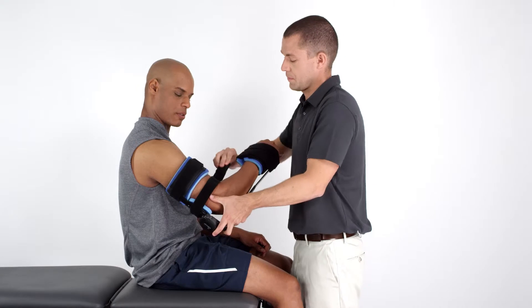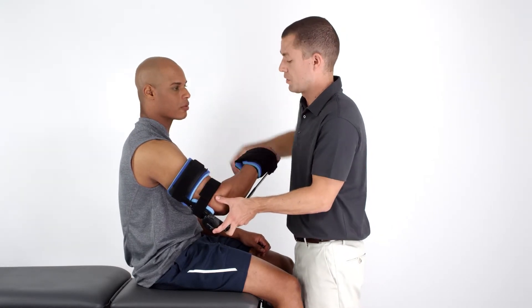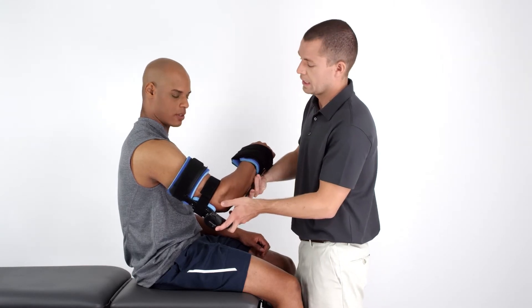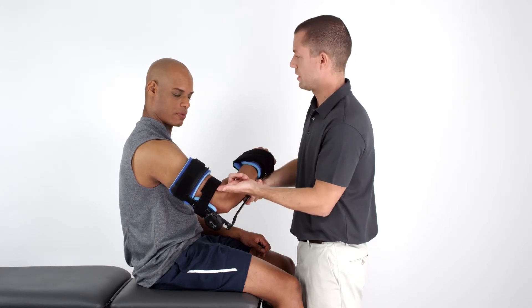These straps can be attached loosely since their purpose is to keep the stabilizing bars in place. However, the middle strap should be snug enough to allow one finger to be inserted between the strap and the skin.